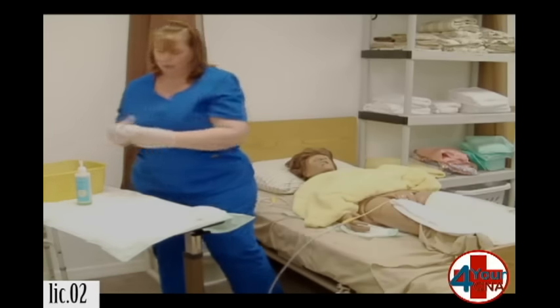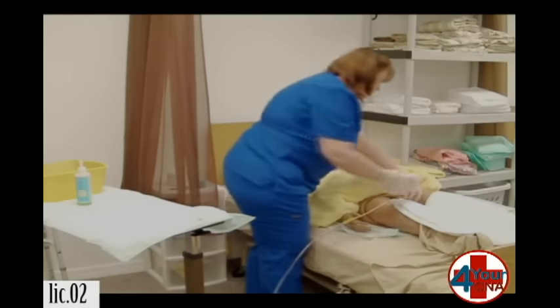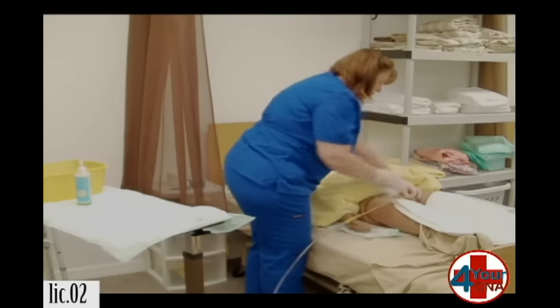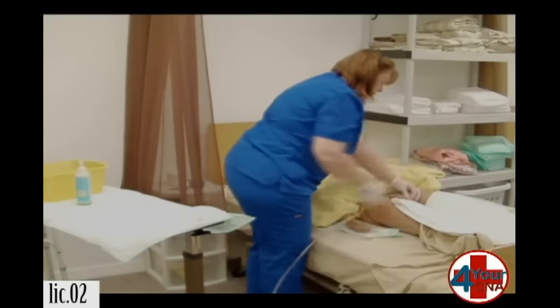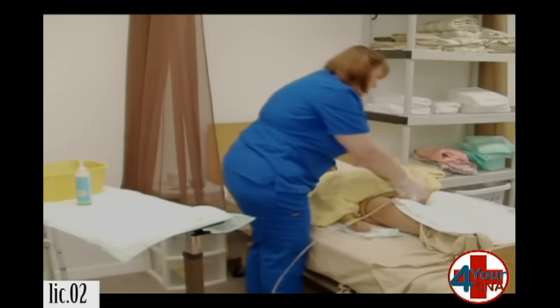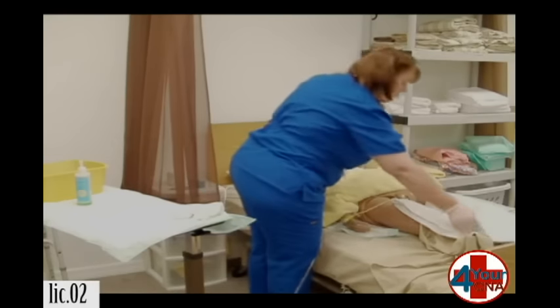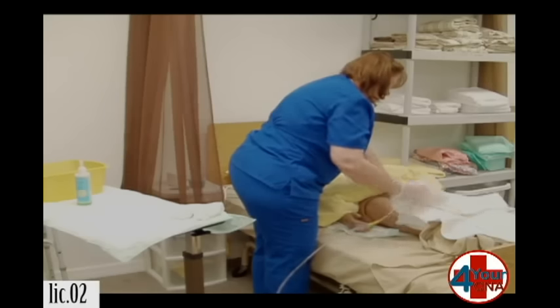Wring that out really well. And now we're going to rinse those same areas. Hold the tubing. One. Fold it over. Two. Fold it over. Three. And one. Set that aside. I'm going to use a corner of the towel and we're going to dry the same way.